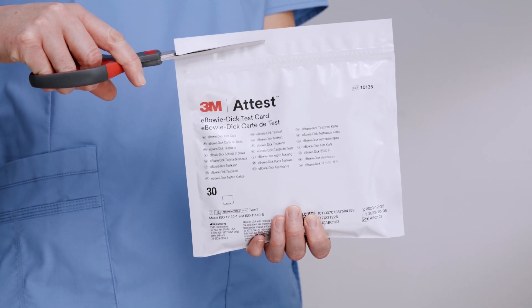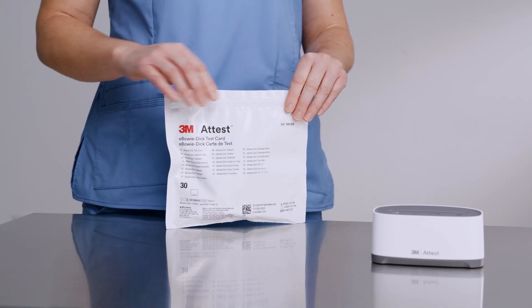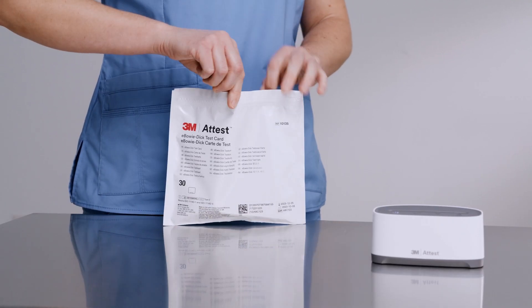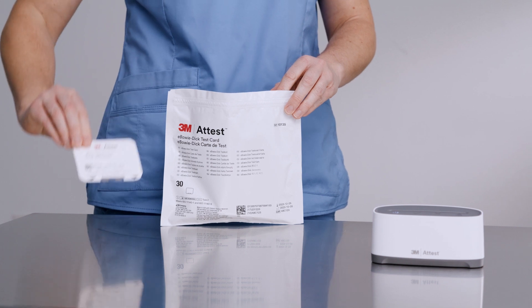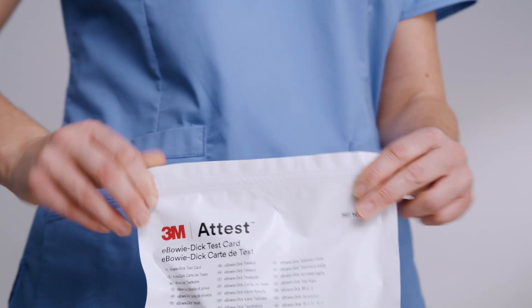Tear or use scissors at the tear notch at the top of the package to open. Remove only the amount of eBowieDIC test cards needed. One test card should be used for each sterilizer being tested. Re-seal the remaining test cards in the package.